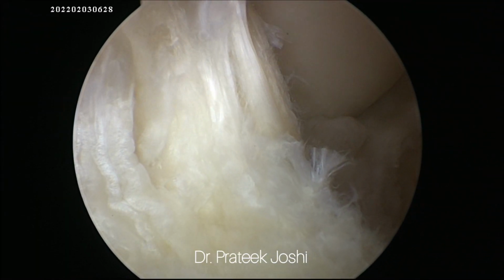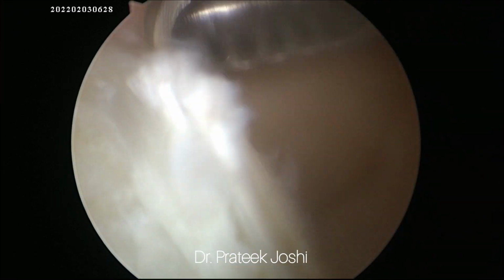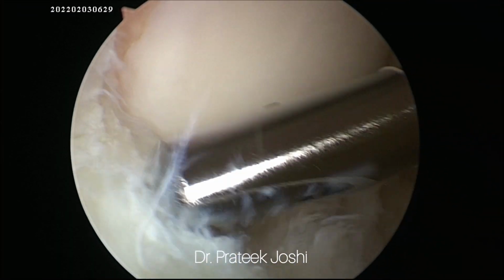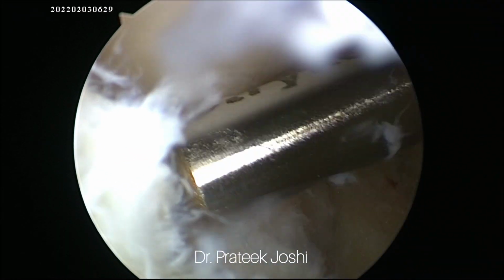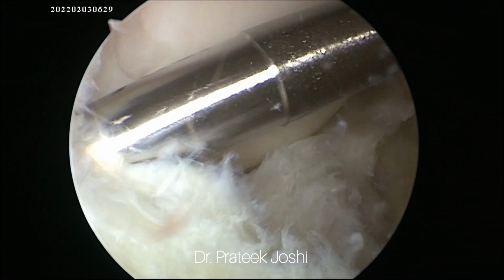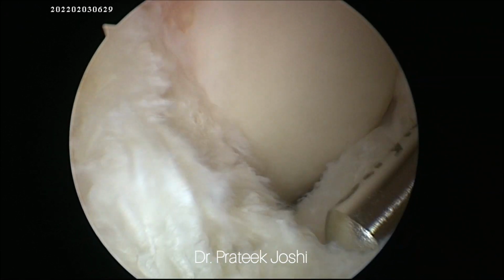Now I have changed the portal, and now I have introduced my arthroscopic shaver from the anterolateral portal. Sometimes if the tissue quality is not good, we remove the ACL in its totality, but still not all of the patients will face instability. And if the patient's lifestyle is active and in a slightly younger age group, we also would like to do ACL reconstruction after debulking of the ACL. In this case, the lifestyle of this patient is not that active, so we are not going to do ACL reconstruction, and we are just going to do ACL debulking.